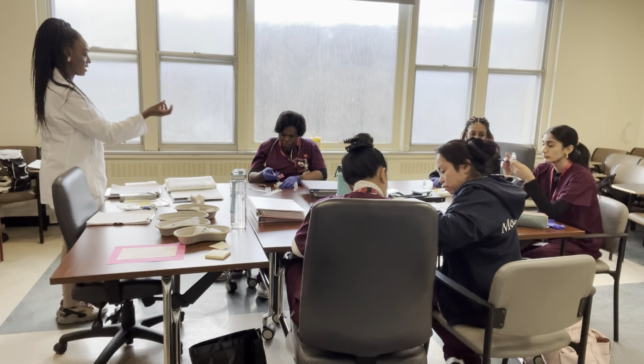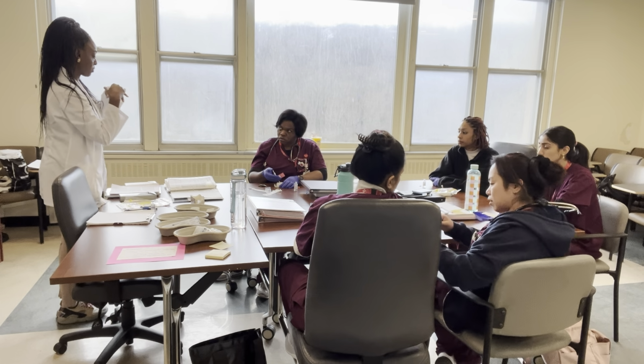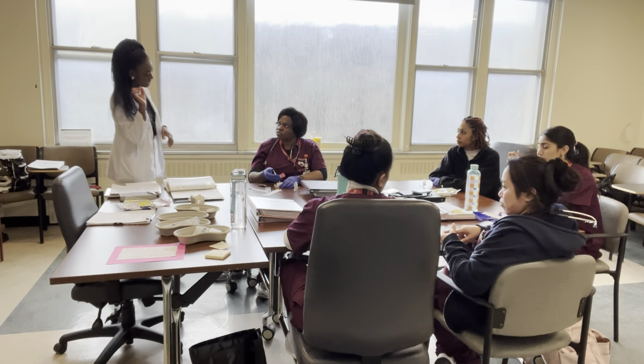And then why did you let go of the complete needle? You always hold the needle because if not, you can bend it and still cut the person. So you don't inject and then let go of the needle and then place your fingers and do it again. Yeah, let's go with the injection process again.